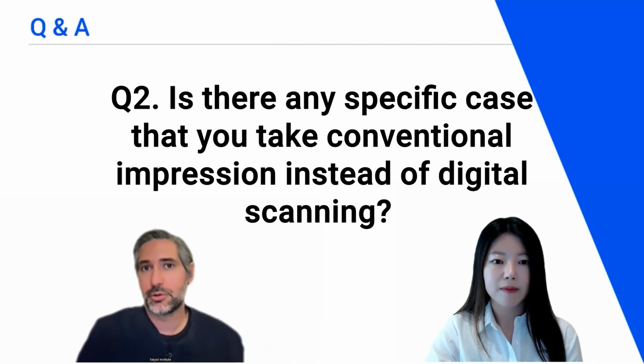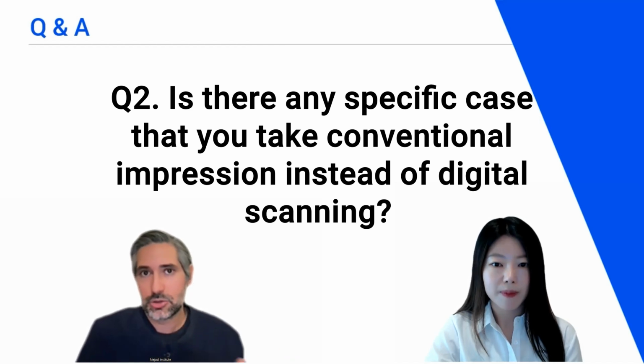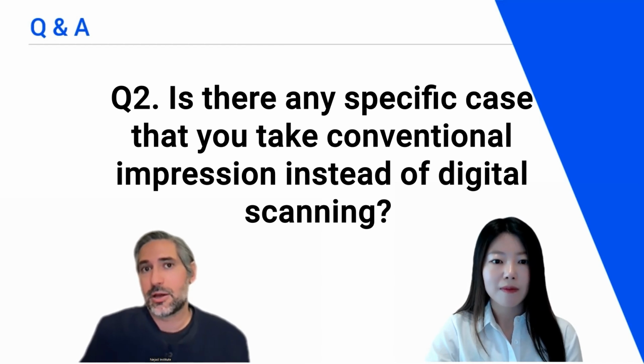And if you read the literature, it's not really showing anything that says it's way more accurate, but my experience was things fit a little bit better. The margins were cleaner. So I started using it for all that. And so now I don't take an impression for those cases. I just do my scan and I don't need a backup because I have the confidence in it. But now you would think I do everything with digital scan.